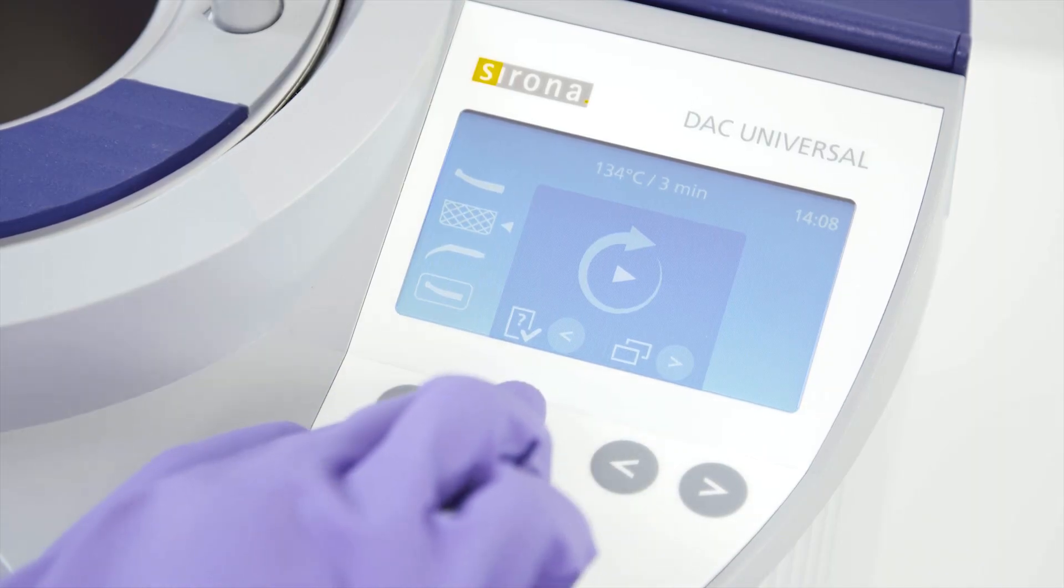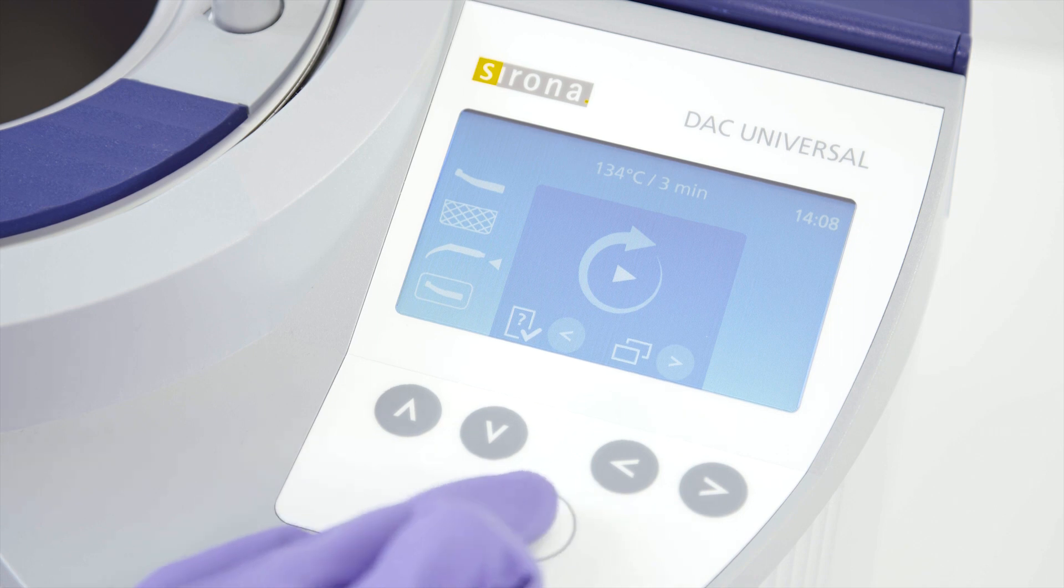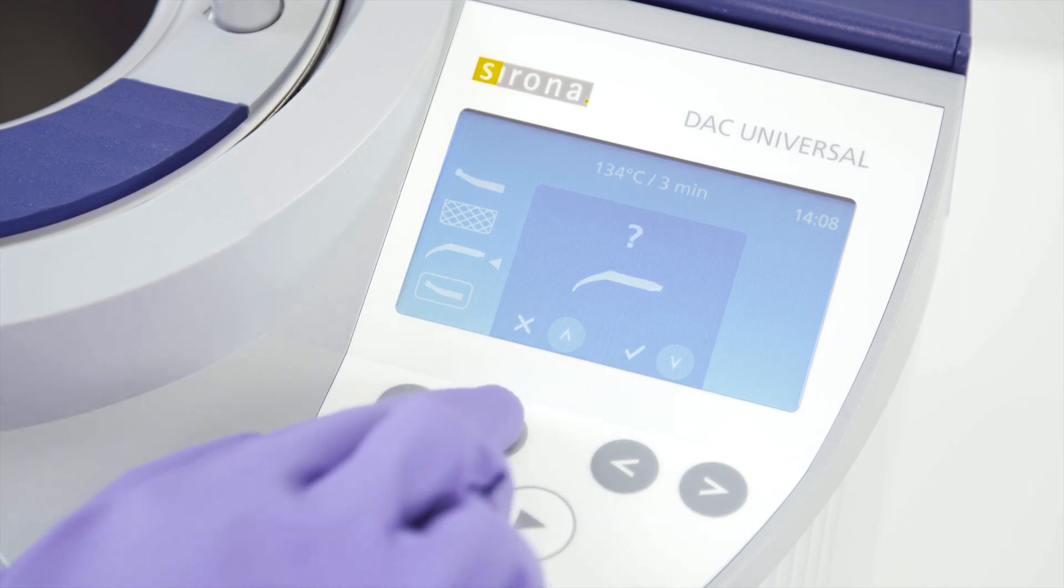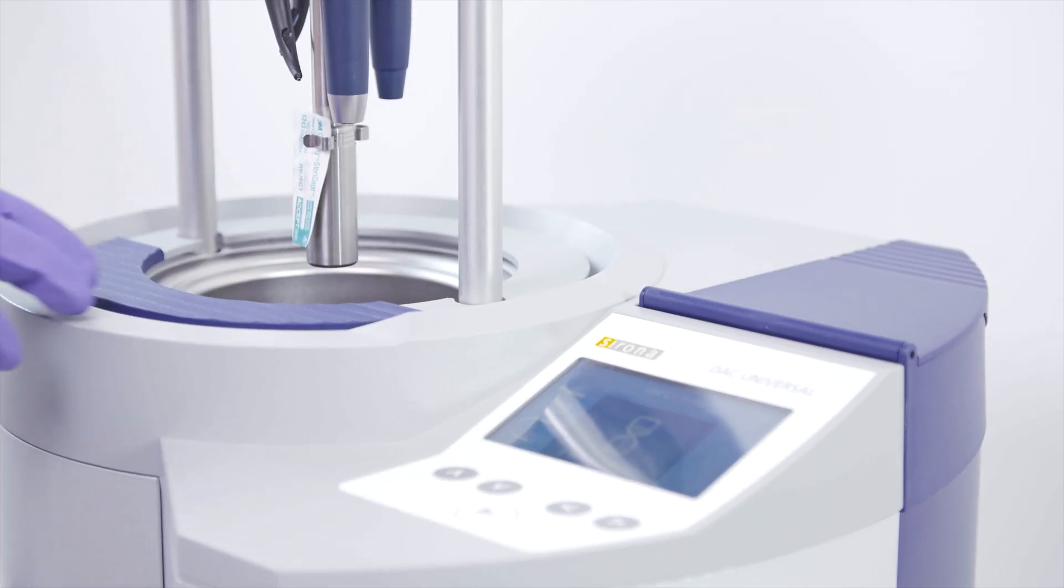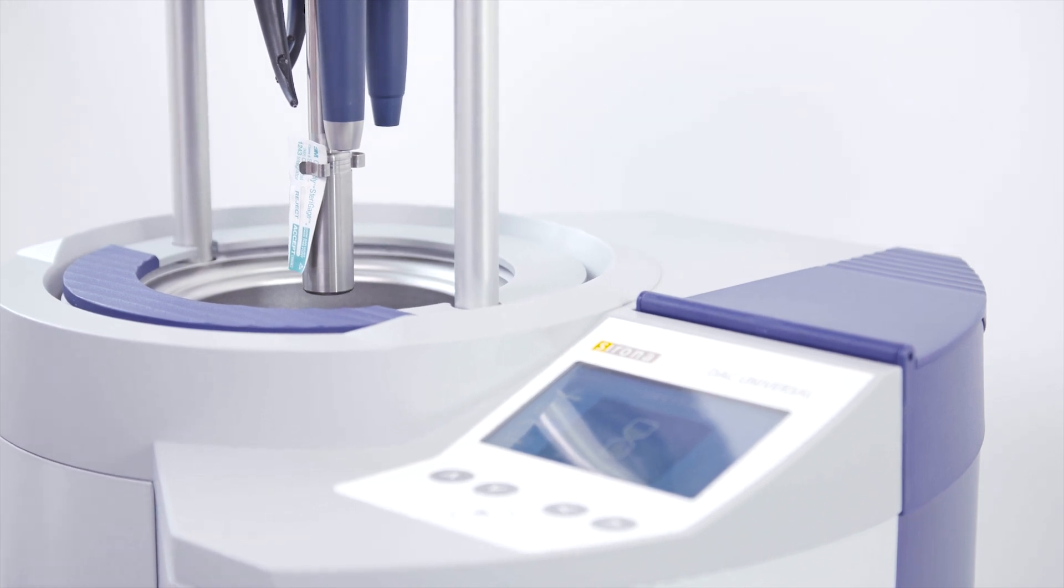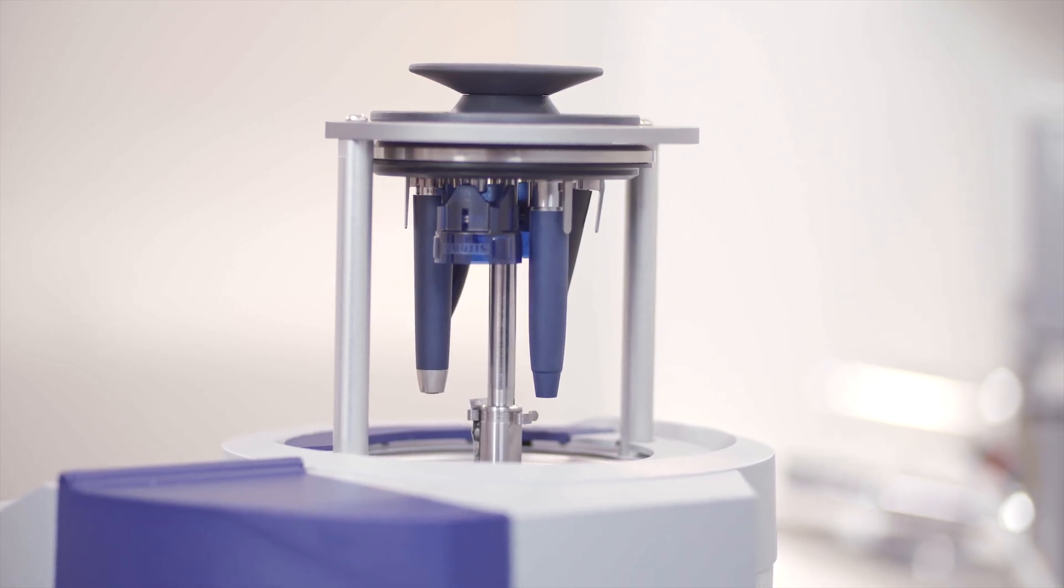Next, select the flex lid. After clicking on the start-stop button, selection of the flex lid must be confirmed by pressing the down button. By subsequently pressing the safety ring, the cycle is started and the lid closes.